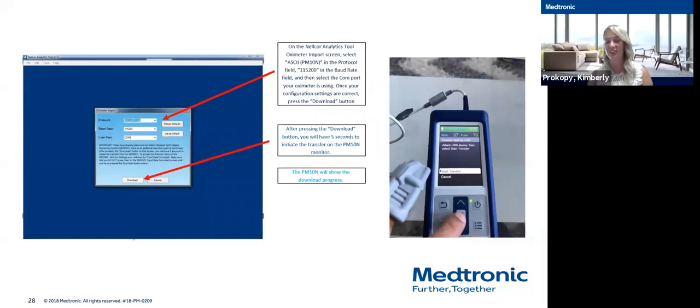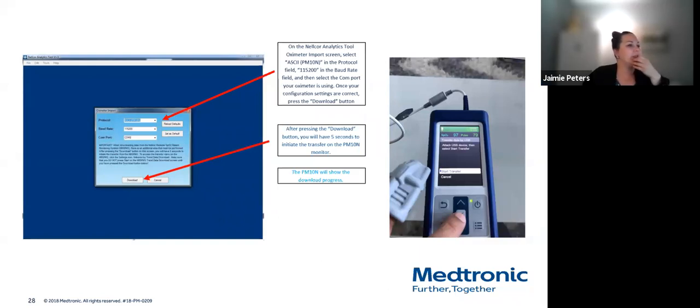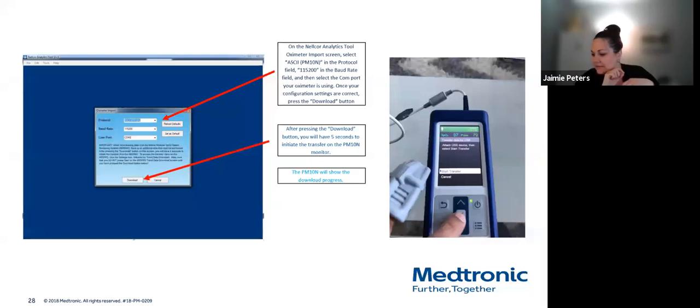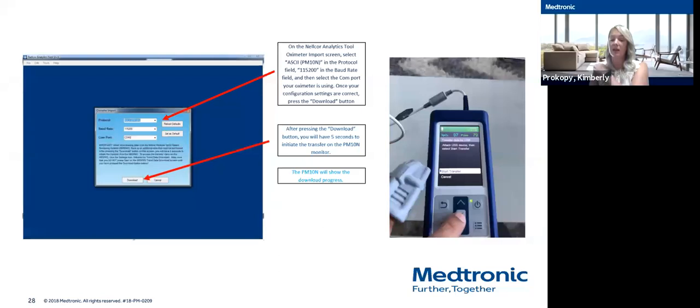I know. The other thing he said is that his Excel transfer is cumbersome and takes up to 30 minutes. Do you think that's probably because he has that setting wrong that you mentioned earlier, the ASCII? Yeah, so it could be his setting. I would be curious to know if he's doing continuous data or spot checks, and if the spot checks might work better for him. If that's something you typically do in your program, that might be why, he's trying to transfer a lot of data. So I would ask if he's using continuous or spot check.